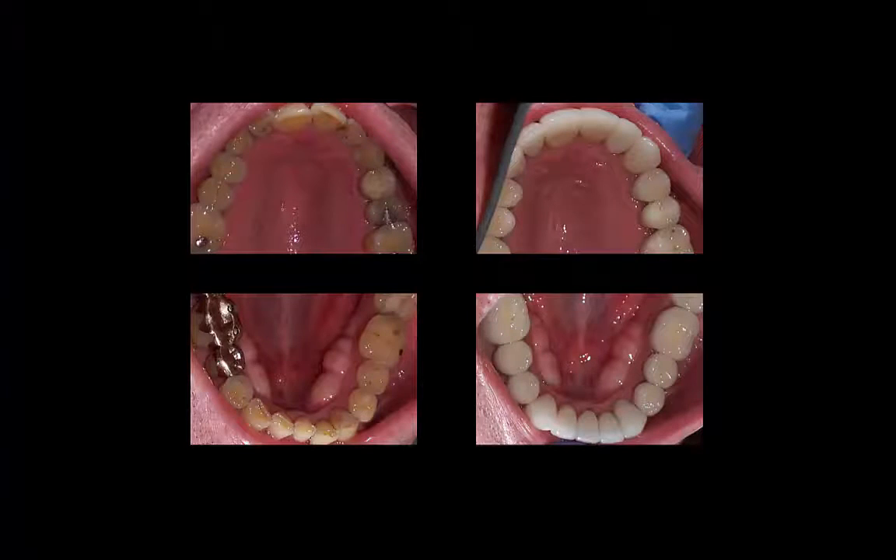Here are the before and after pictures looking at all of his teeth. On the left side is the before, and you can see the back teeth are very yellow in the centers. This is because he had worn all of his enamel away and was down to the inner parts of his teeth. On the right side you can see where we seated the 28 porcelain veneers that are very strong and should last him many years.